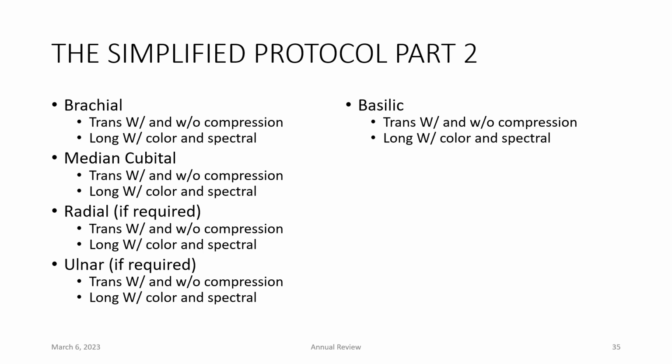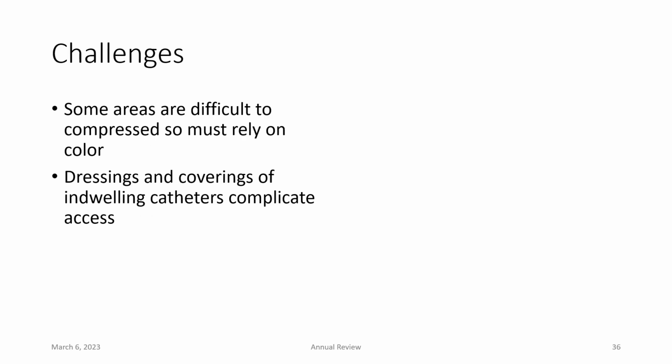So hopefully that's a little bit of a simplified protocol where you can tie all these ends together, maybe make it your own if you don't have a good protocol at your site. You can make this your own, and it gives you a nice little checklist where you can make sure that you've seen everything that you wanted to see.